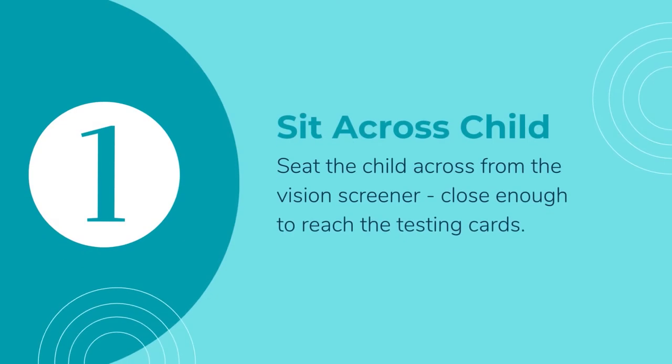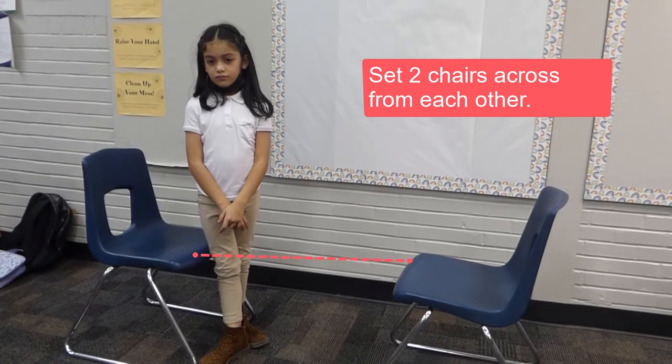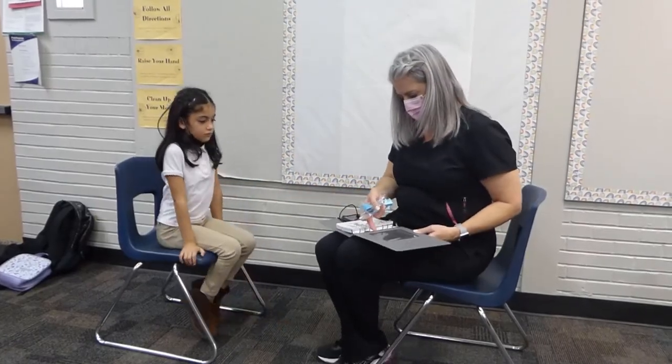Set two chairs across from each other. This can be done with or without a table. Have the child sit on one chair and the screener sits opposite them. The child must be close enough to reach the cards with their pointing device or finger.